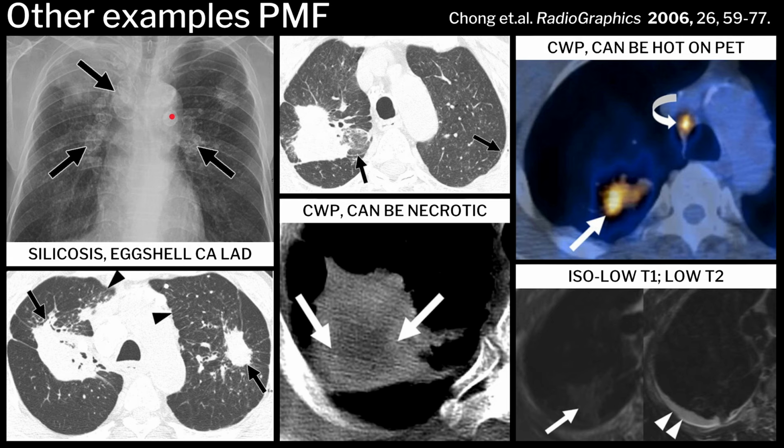So what is progressive massive fibrosis? Really, it represents a coalition of multiple small nodules into a big mass, and that mass is associated with fibrosis. So you'll see traction bronchiectasis, or you see architectural distortion associated with it. So this is a case similar to the one I just showed you. This is secondary to silicosis. This one is due to coal workers pneumoconiosis.